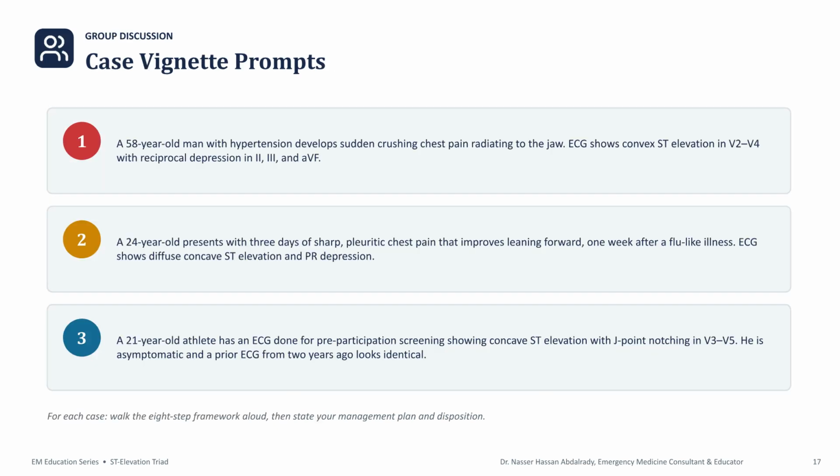To practice these concepts, consider these 3 case vignettes. Each case requires a different interpretation of the clinical findings. Walk through the 8-step framework for each, determine your management plan, and define the appropriate patient disposition.